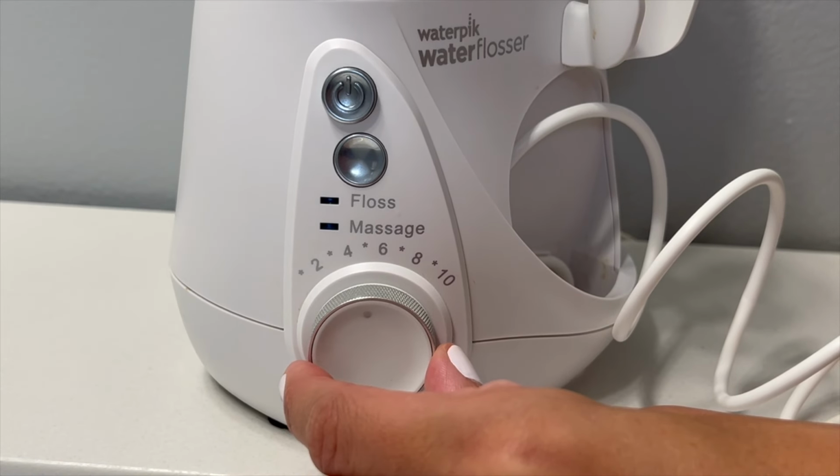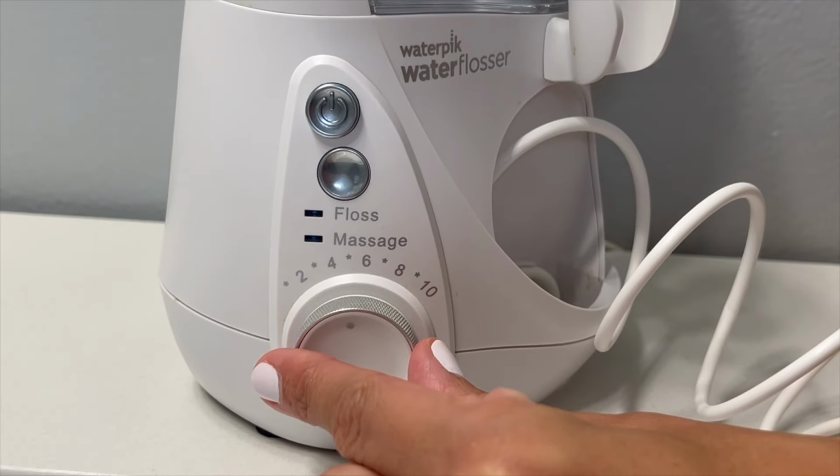Some units don't even have any kind of dial or levels of settings. I usually don't recommend those ones to my patients. I prefer there to be some kind of dial, whether it's 1 through 10 or low, medium, high, or different settings for your gums. You just don't want only one pressure level option. If it just turns on and off, it's usually not the best water flosser. So if you have the pressure dial, I recommend starting in the middle, even like 3 or 4, maybe on the lower end of the middle.